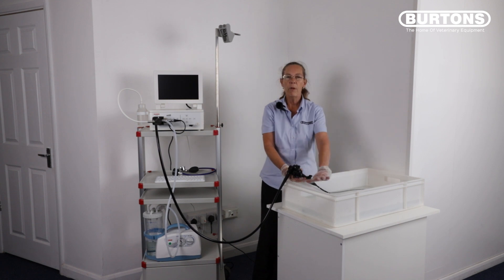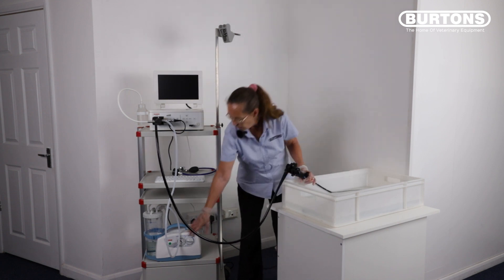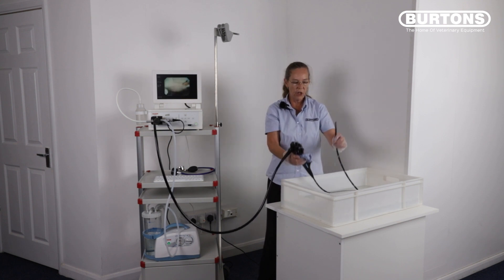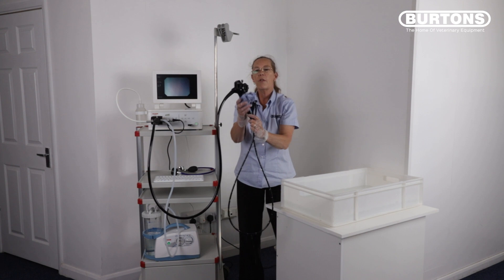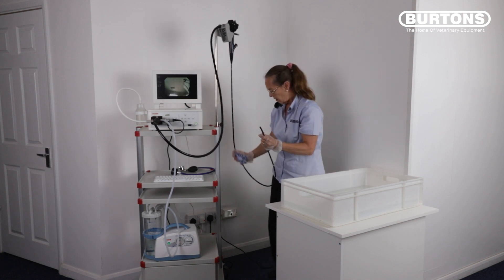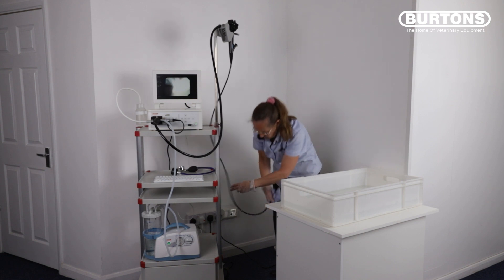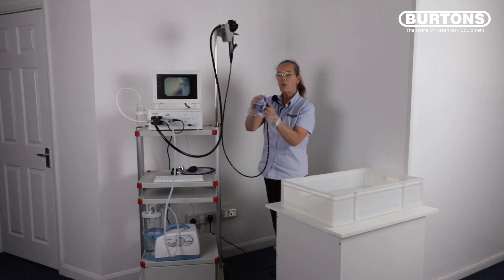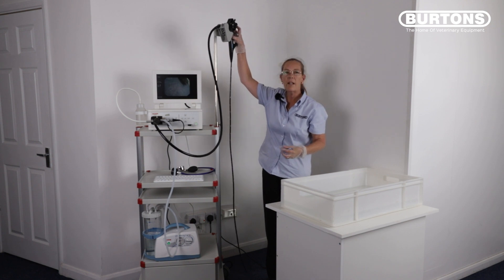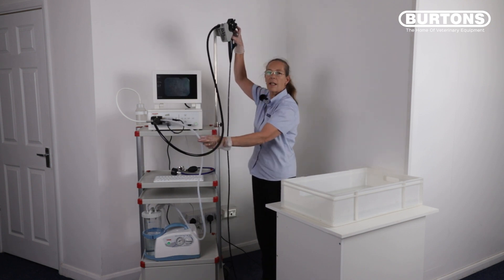Following disinfection, remove the disinfectant and replace it with clean water. Turn your suction unit back on and aspirate approximately 150 to 200 millilitres of clean water through your scope to remove any trace elements of disinfectant from the channels. Remove the scope from the clean water, dry your scope, and hang it back up on your endoscopy cart on the hanger. Dry the patient tube and gently dry the lenses at the distal end of the scope. Push and hold the red button until you don't have any more water collecting in your aspiration tubing.